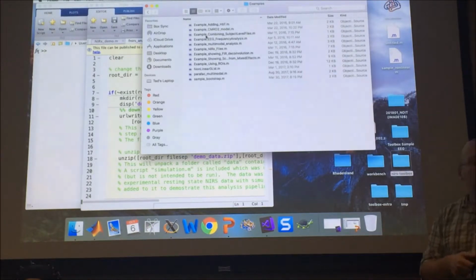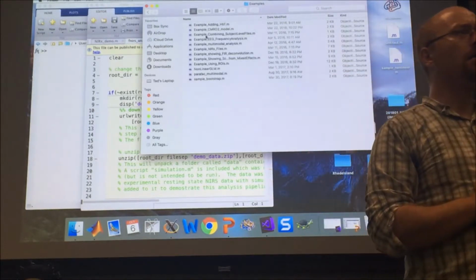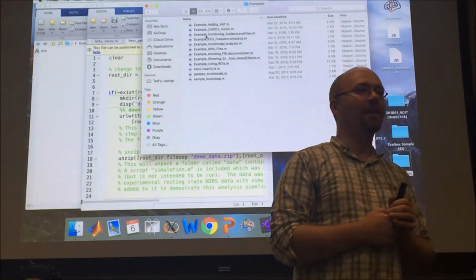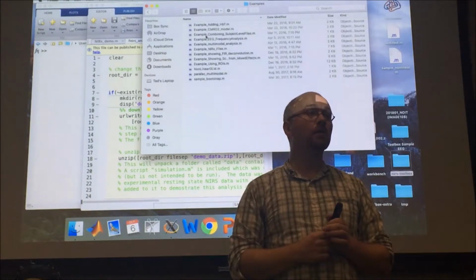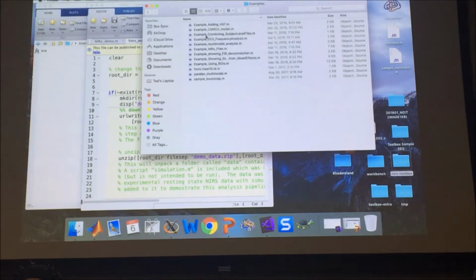Yeah. Our research group is interested in the NIRS and EEG. So yesterday you mentioned your data, so that's also part of it. Yeah. We're actively working on multimodal EEG, fMRI, MEG, and a lot of that is in here. Thank you. So if I have time for that, I'll show a little bit of that too.